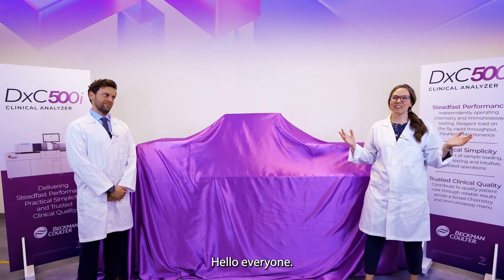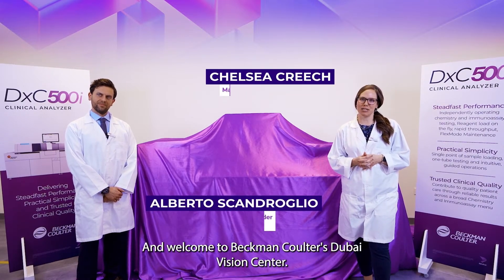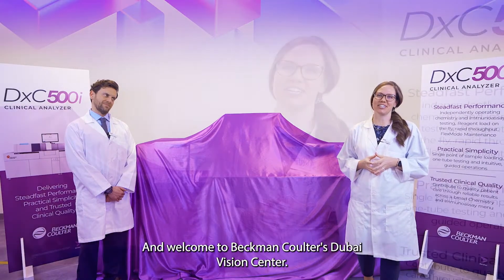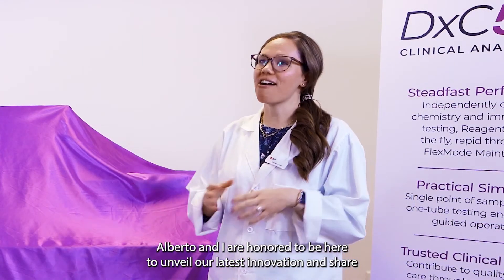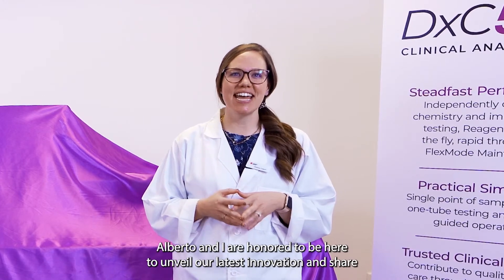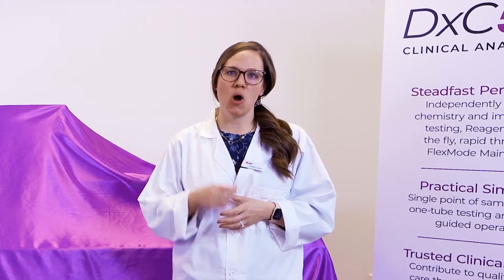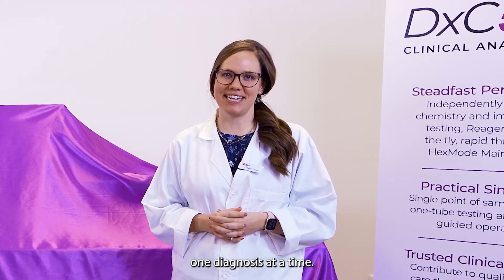Hello, everyone. Thank you for being here with us today, and welcome to Beckman Coulter's Dubai Vision Center. Alberto and I are honored to be here to unveil our latest innovation and share how we can relentlessly reimagine healthcare one diagnosis at a time.